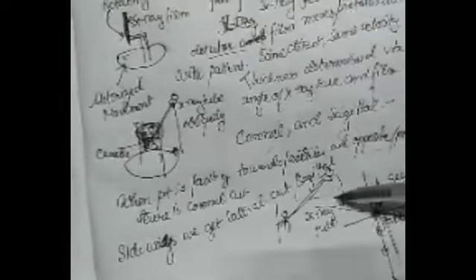This is the patient body, and this is the X-ray beam coming here. So where is the bisection point? Right here. Whatever image is formed here, this area will be seen on the film. Here, a patient is sitting and this is the direction of the film. This is the ray coming. Which is the bisection point here? This one. Whatever image is produced here will be uplifted here. This way we take the images and we form the transaxial tomography.